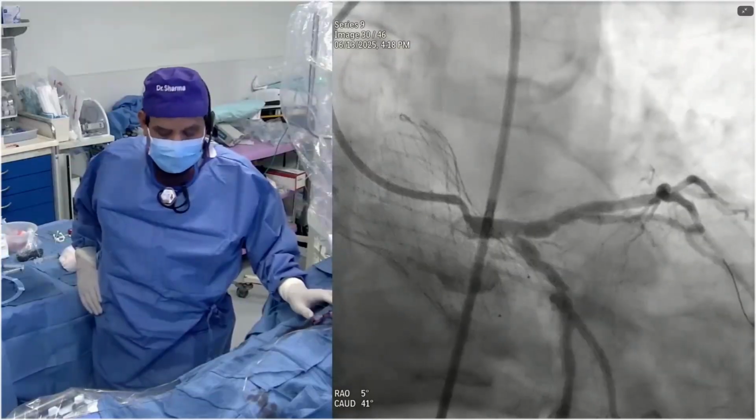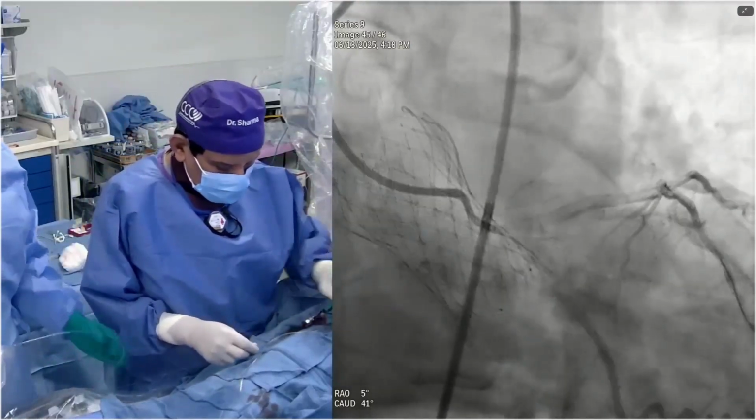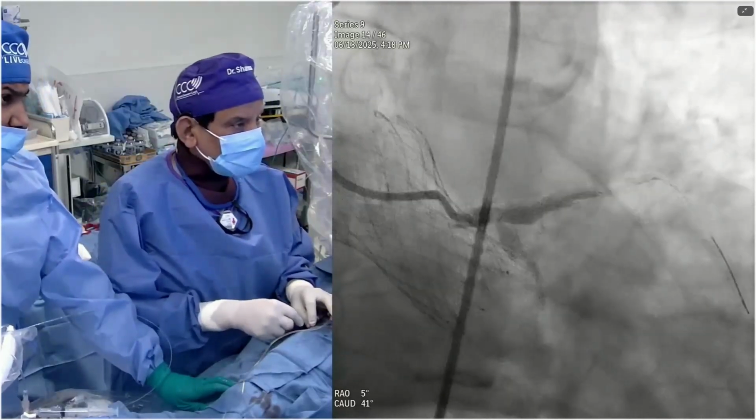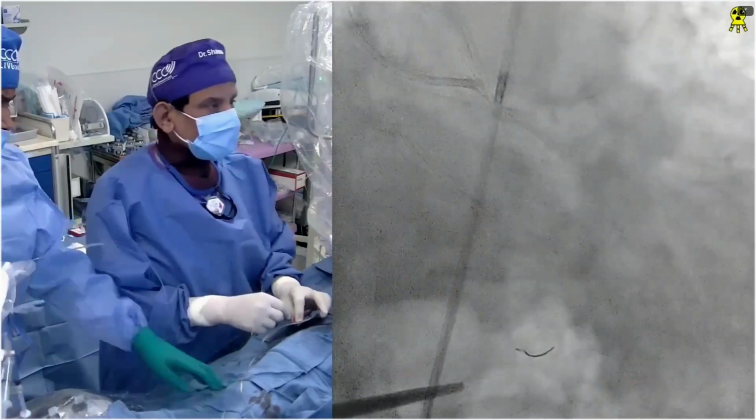Looks like this is a tighter lesion, and we are ready now to do the IVUS with a little support, as you can see there. Now we put a Runthrough wire into the circumflex. Godzilla is there, and I'm doing an IVUS of the circ now.